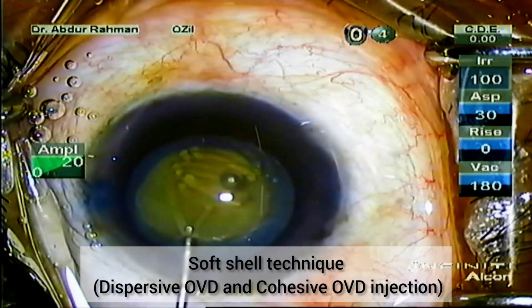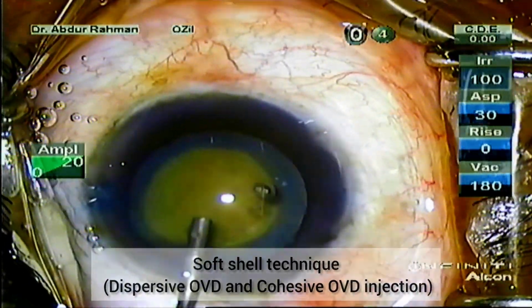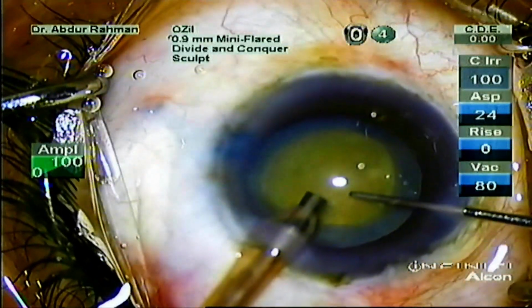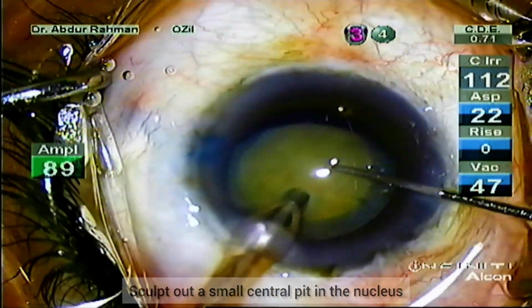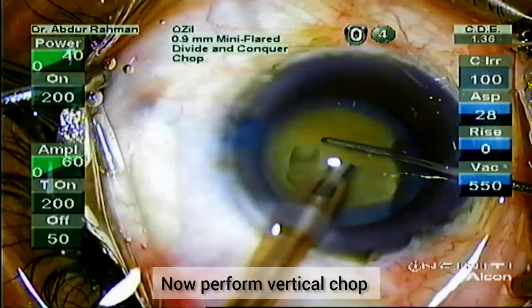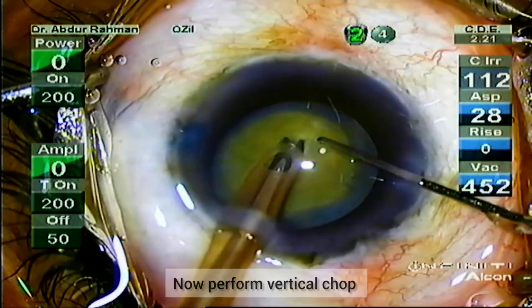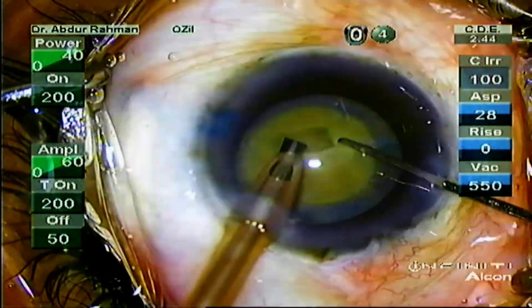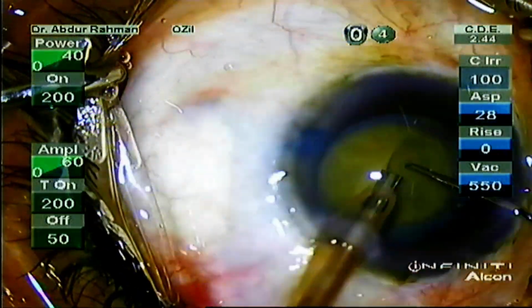Now, before starting phacoemulsification, replenish the anterior chamber with dispersive OVD and cohesive OVD to form a soft shell technique. Now, groove a small center pit in the nucleus. Now perform vertical chop. This nucleus is highly mobile and rotates, but I was successful in propagating a crack.